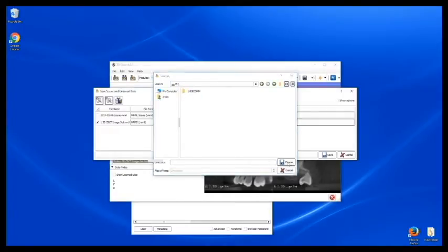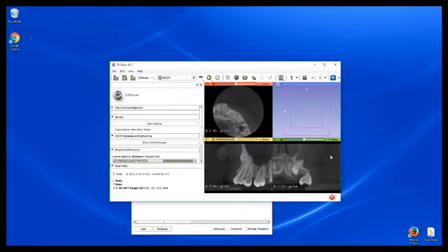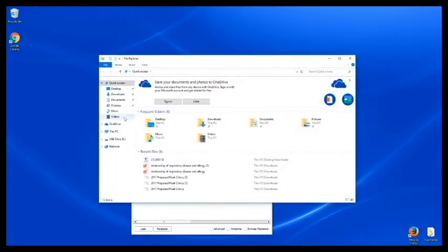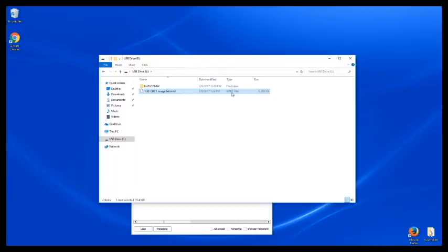And I will save it to my USB, and you should see your NRRD file here.